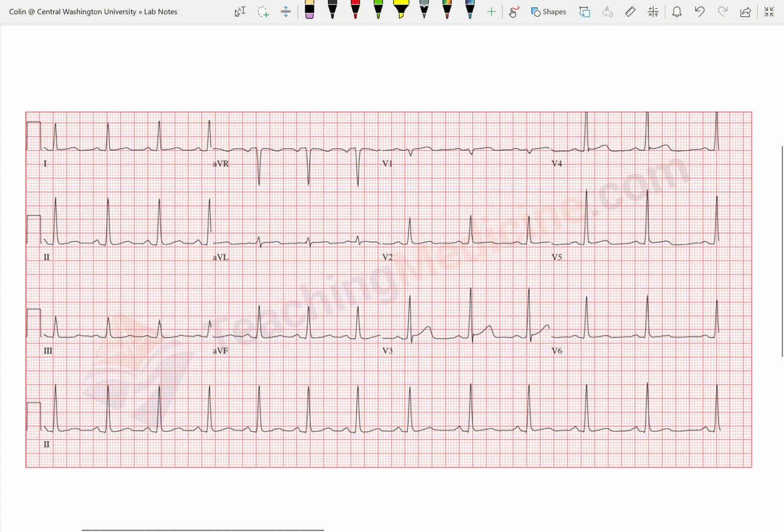And that's exactly what's happening with our 12 lead. Our 12 lead looks at different parts of the heart, and if there's damage or like a heart attack, right, if there's a blockage in a certain part of our heart, the leads that look at that part of the heart are going to show that there's an issue, okay? So let's break down real quick what looks where.